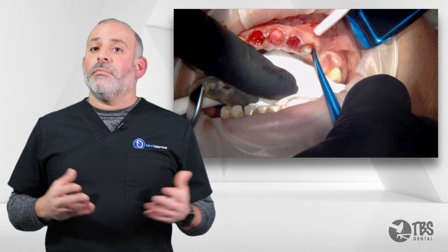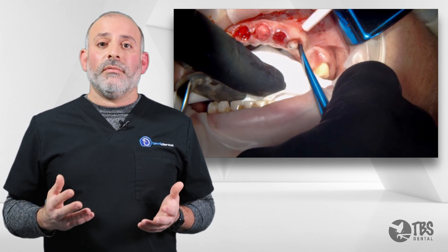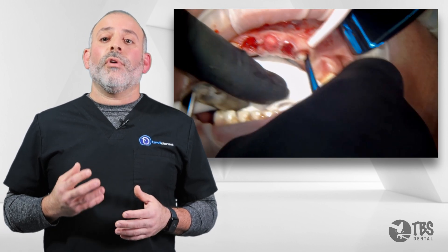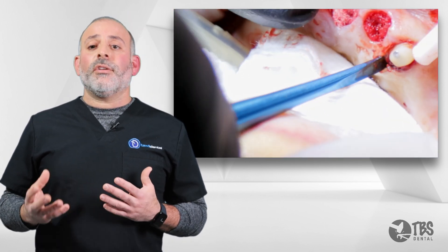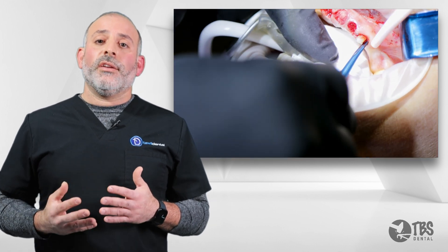Fortunately, the alvatome can do this as well. Without having to use any expensive equipment, just using the right concept, the right instrument, and the right technique, we can begin to mobilize the root. And again, this is not a race — we take our time and we work from different angles.